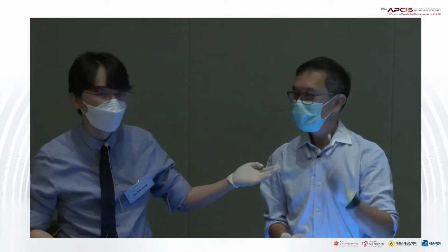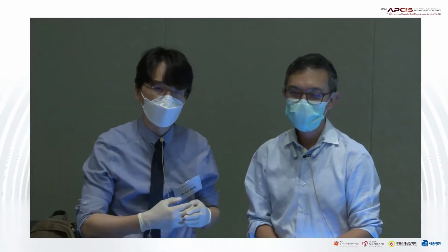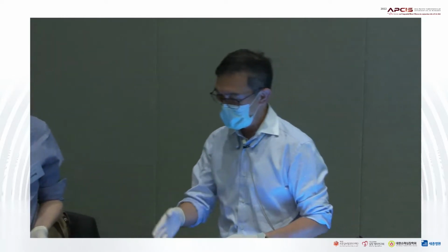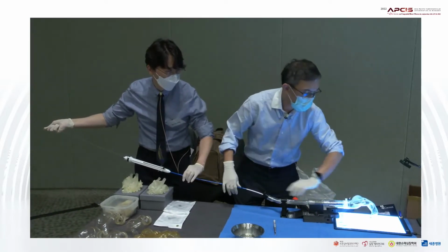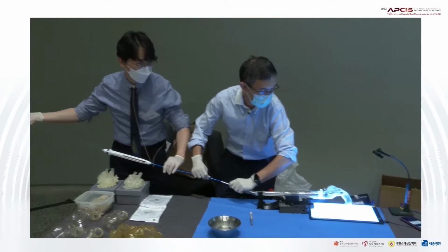So-Ick Jang from Sejong General Hospital, and Dr. Worakan, a very famous interventionist from Thailand. We will perform the Pulsta valve implantation. Yes. Okay, you can start. Yeah, so maybe if you can introduce your valve a bit. This is the Pulsta valve, right? No, if you can hold the wire a bit. Yeah, hold the wire. Okay, so now you can see it is tracking.